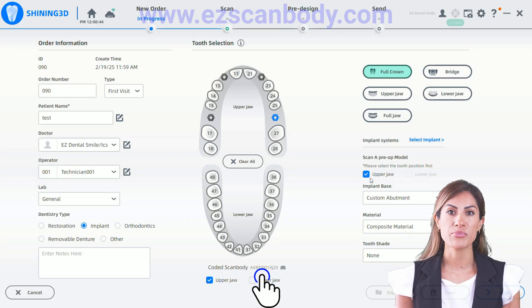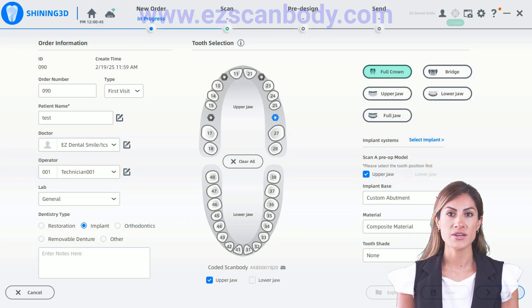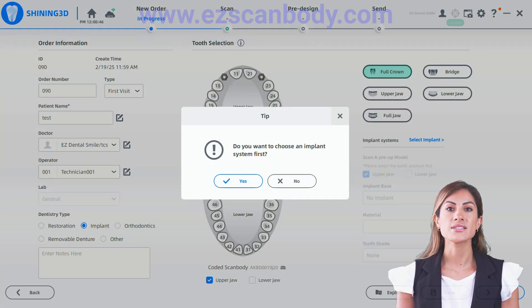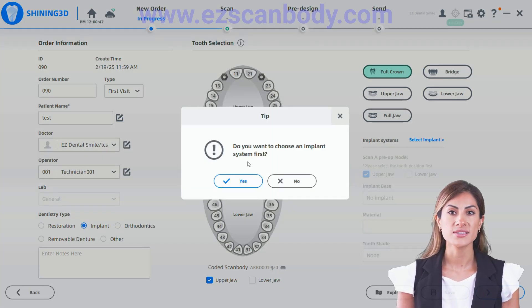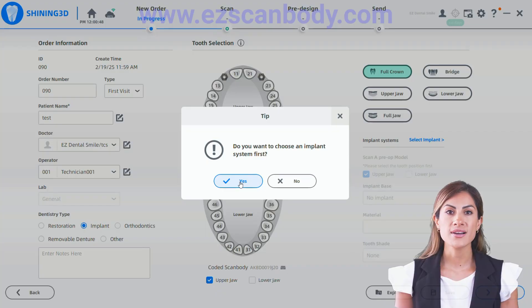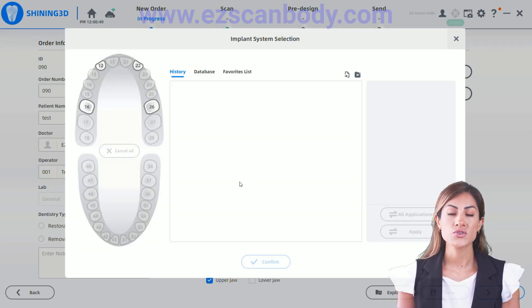If you need to scan a pre-op, check the box next to it. Next, select the implant system you wish to export.